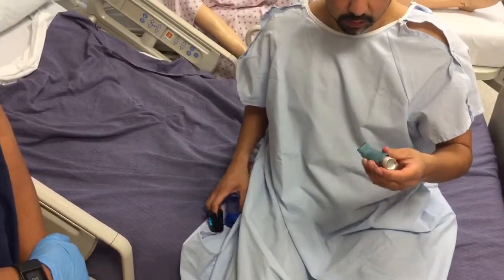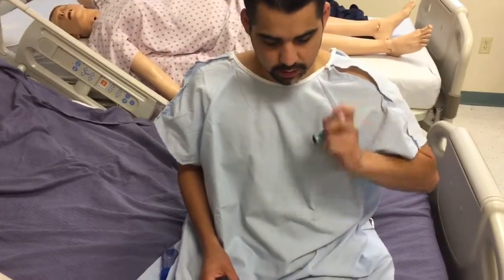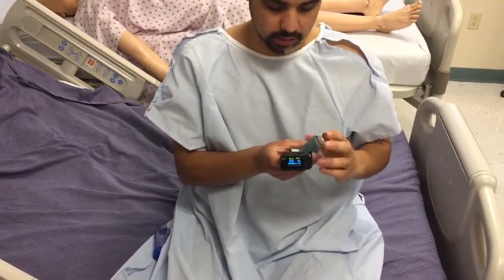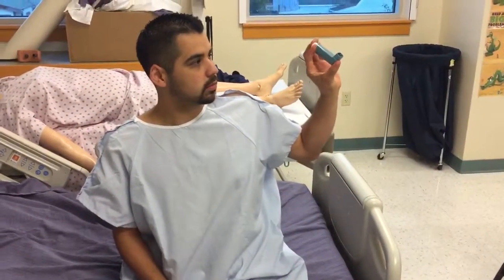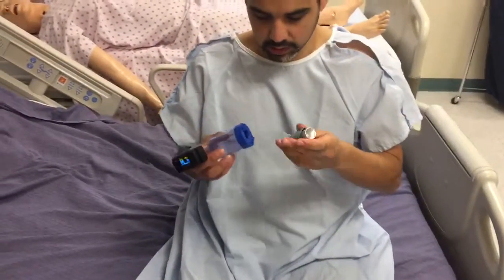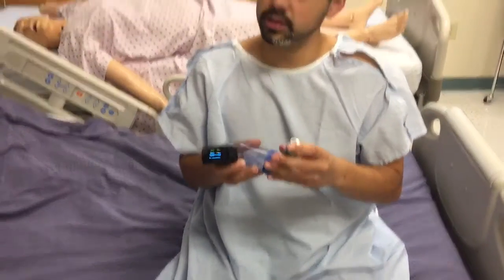Then I'm going to shake it, and prime it away from me in the air. It means it's ready. Then I'm going to get the spacer, and this helps the drug go down to my lower airways.